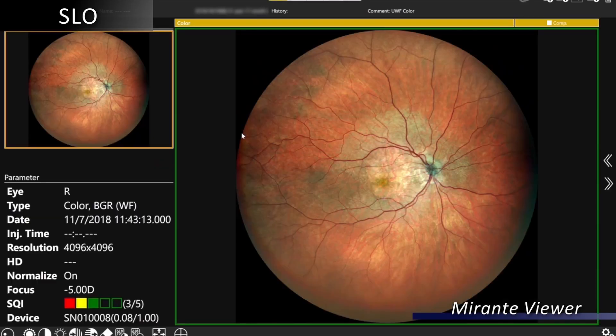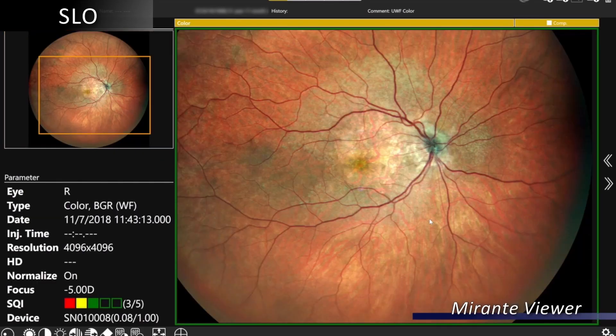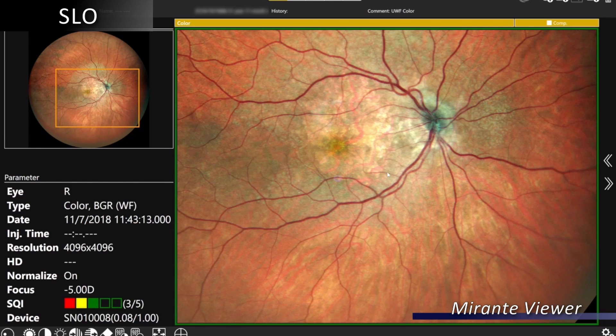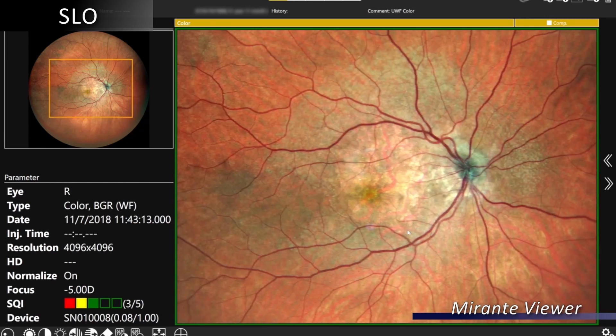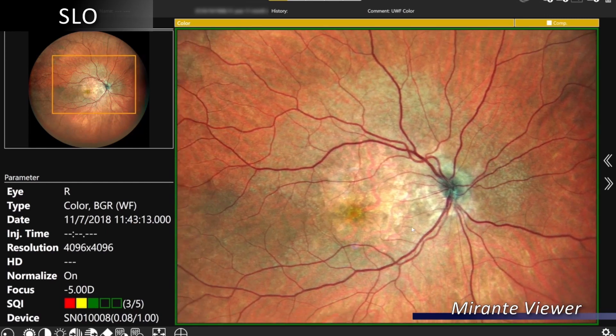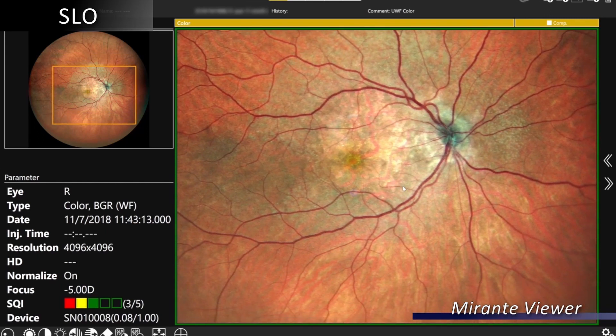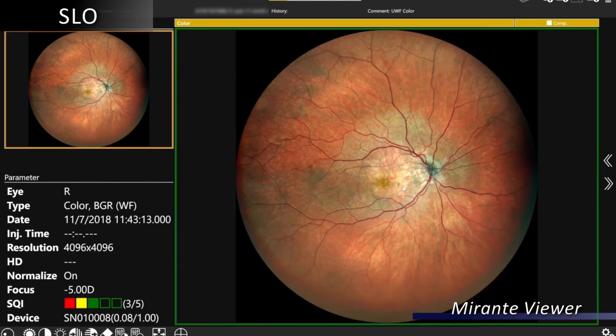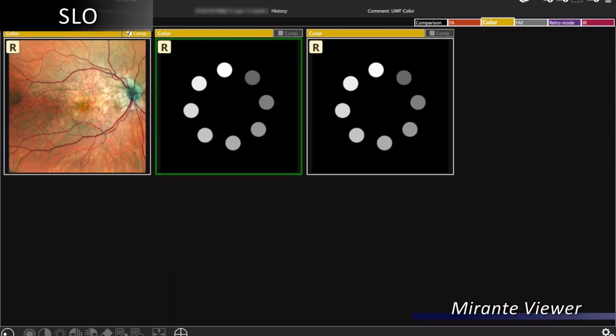Also, our high-resolution 4096 by 4096 color fundus imaging provides high-resolution evaluation of the fundus.